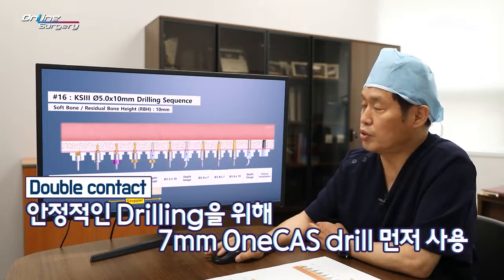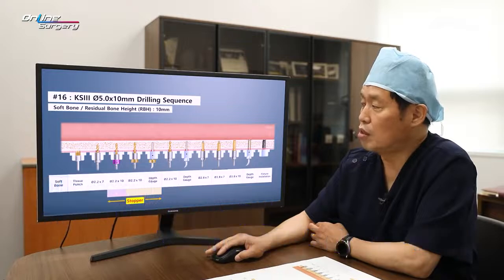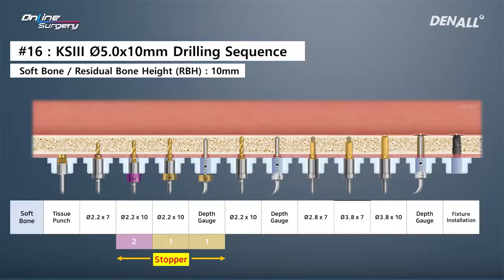You need to use the double contact concept for drilling in order to improve stability, and as shown, you need to use 2.8 and 3.8 by 7 millimeter drilling. After that, you can use the final drill, 3.8 by 10 millimeter. With the depth gauge, check whether the sinus floor is penetrated and then place the implant.